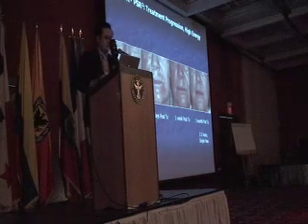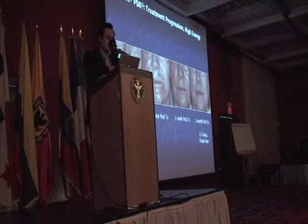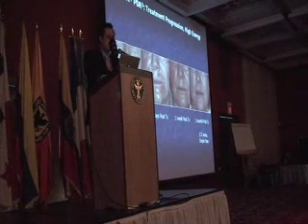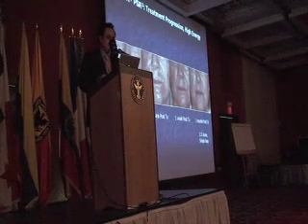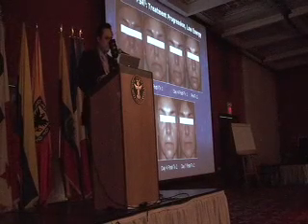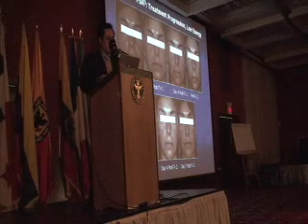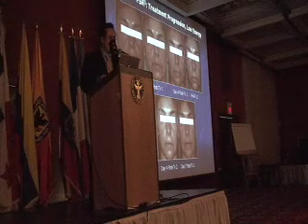This slide from the company shows improvement over a period of 1 month. I think this is a little bit too early, in my opinion, to see some of the deeper wrinkle changes. I'm going to show you some of my results as well. This is a PSR3 setting, and you can see that there is a pretty quick recovery period over that 7-day period. Although again, I would tell you that it may be a little bit longer than that.